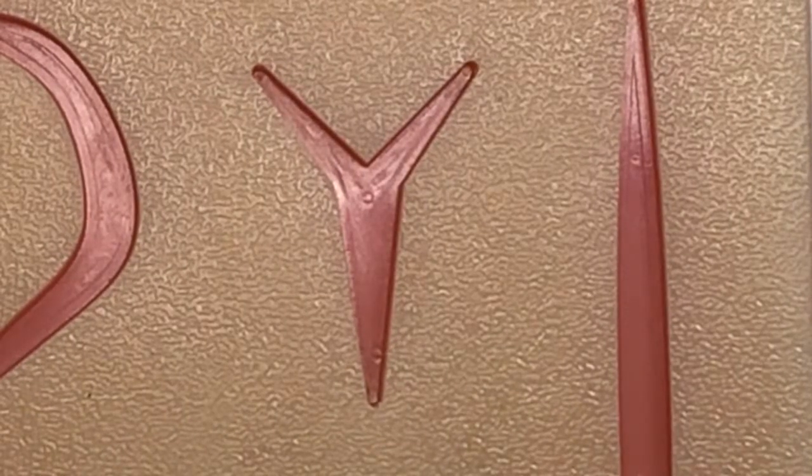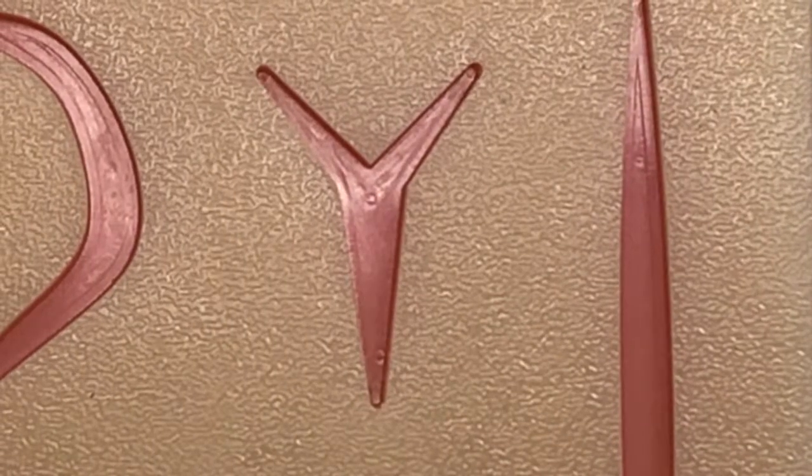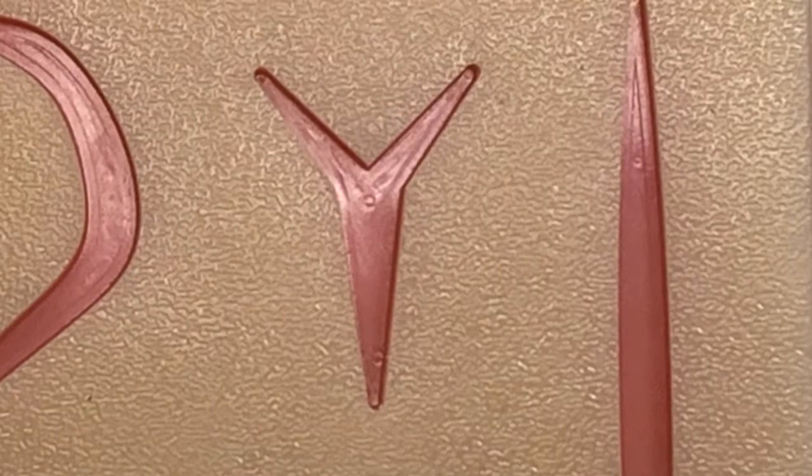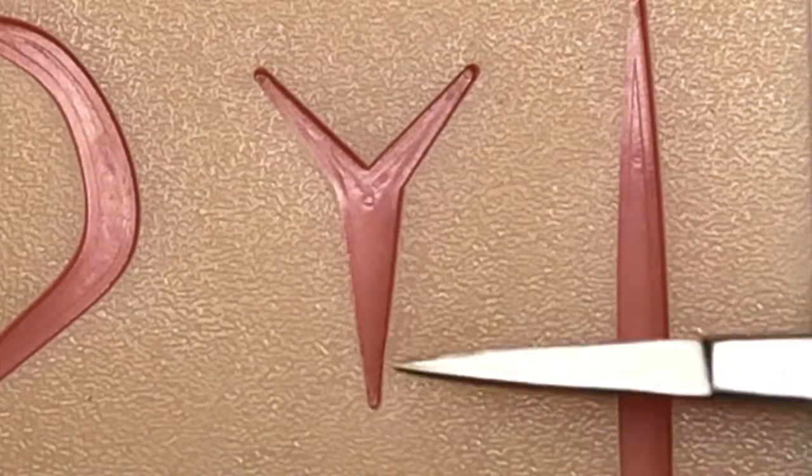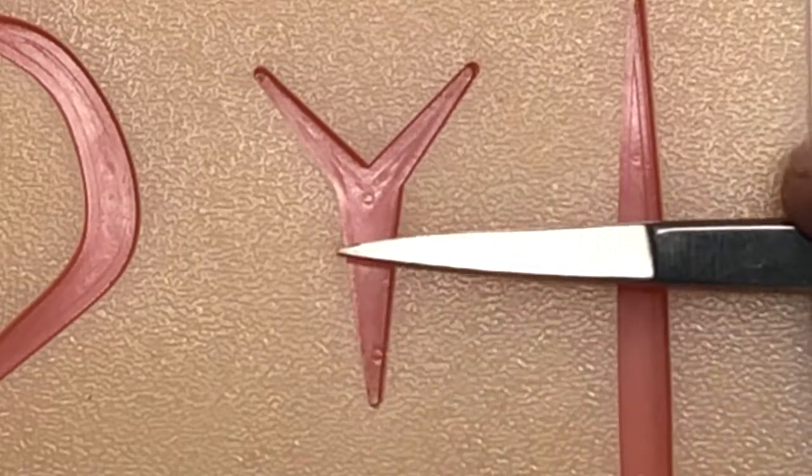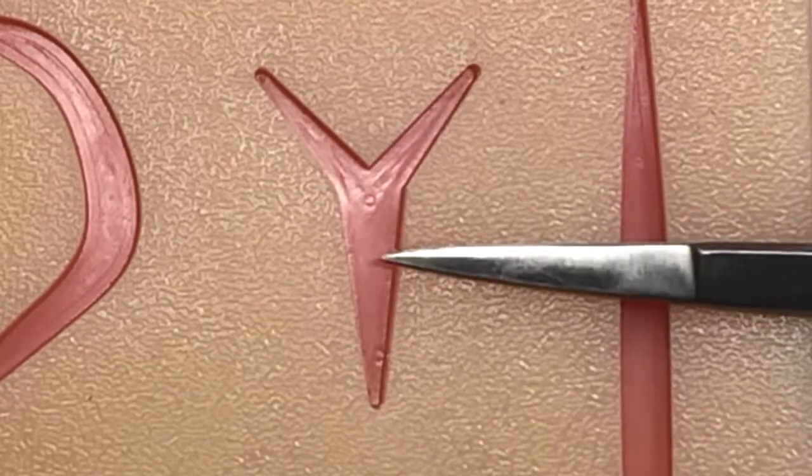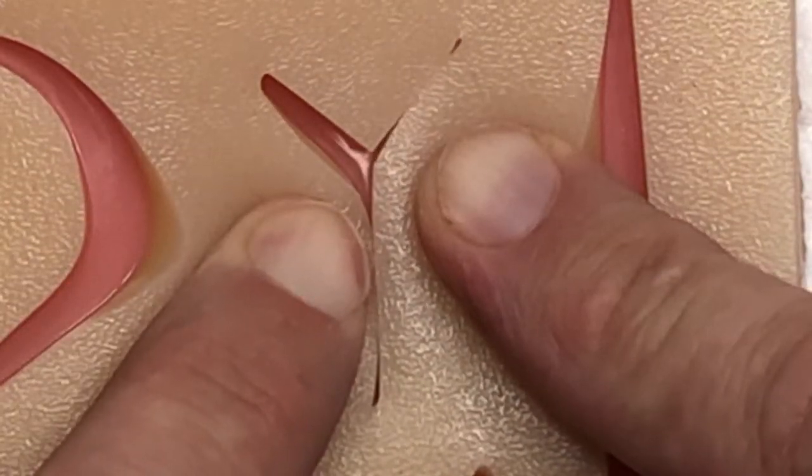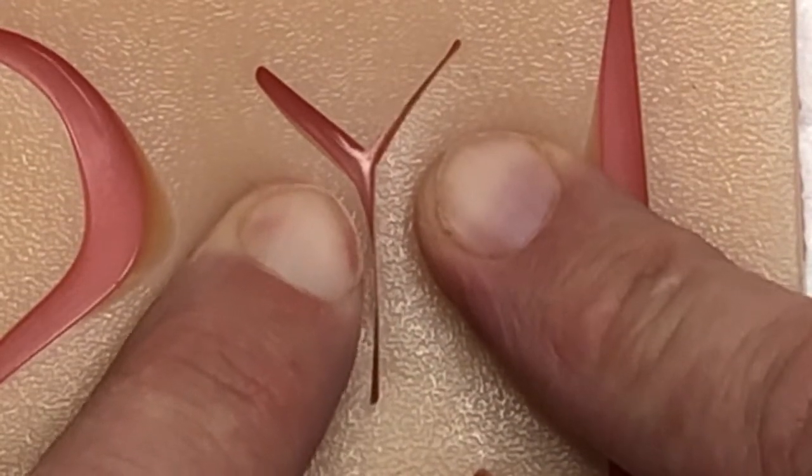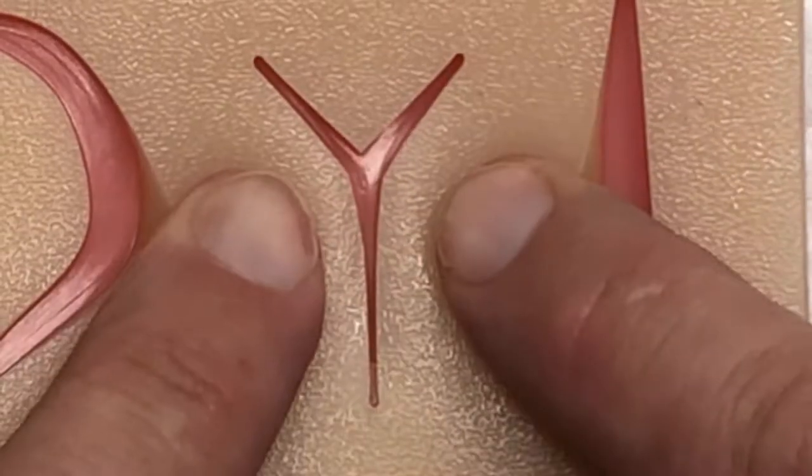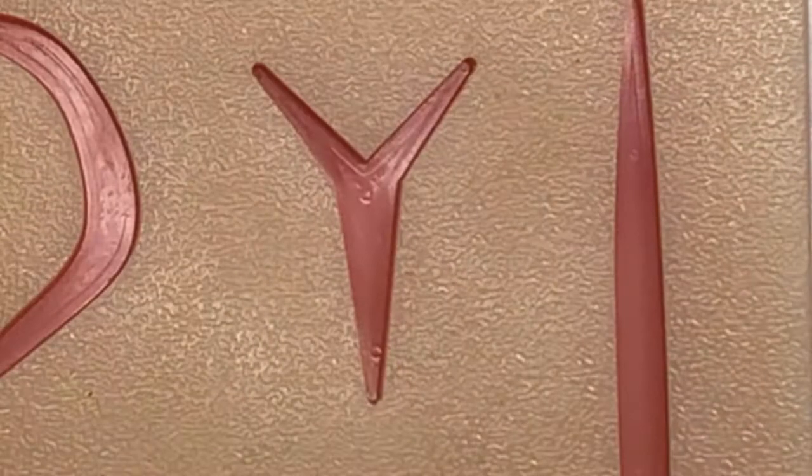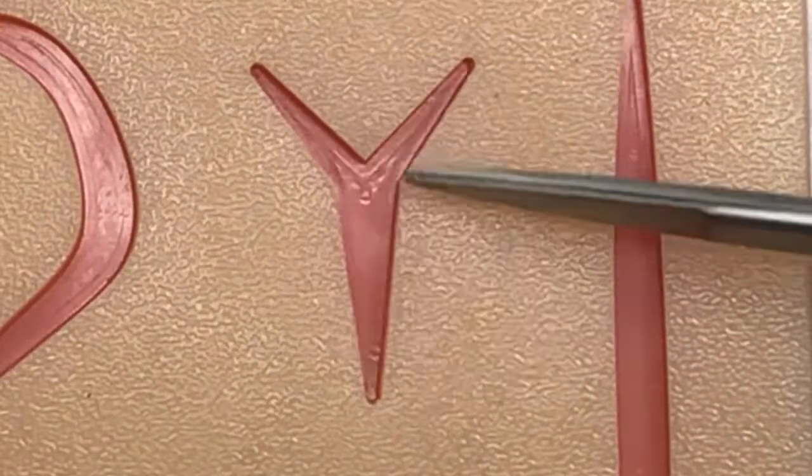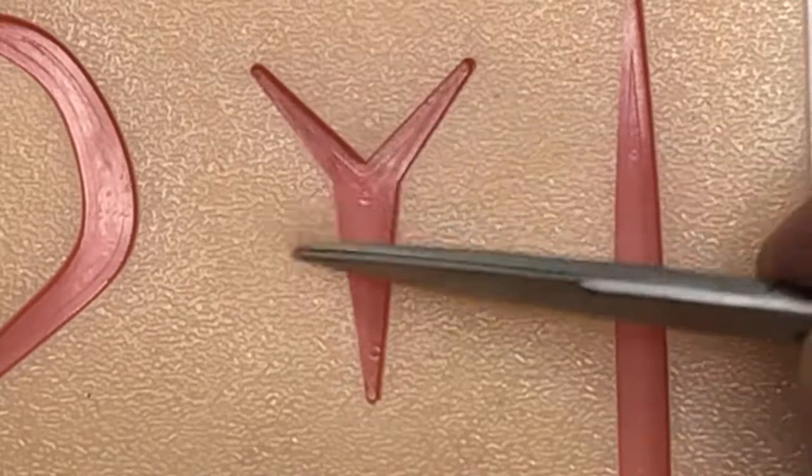So how I want to look at these is what am I going to be bringing together first? If you start down here at this end of the wound and you start repairing, if you miscalculate, you may end up getting tissue edges that are going to be a little bit too long, too short, and you don't want to do that. So I think that the most important thing to do is to work on trying to close the apex here of this wound. This is the tricky area.